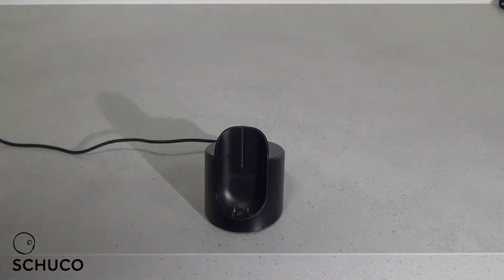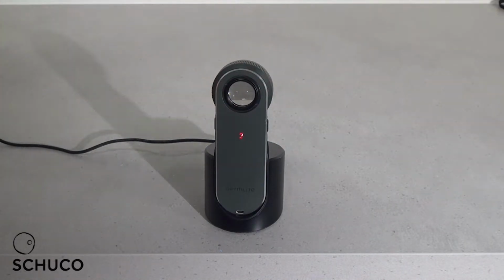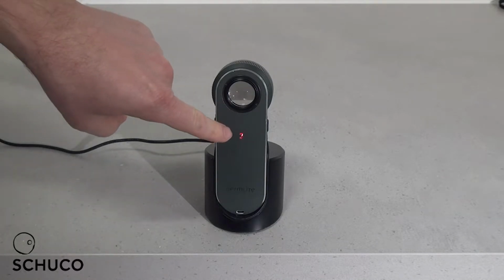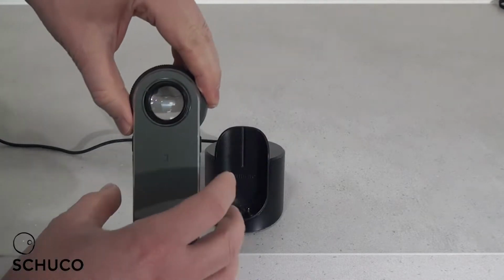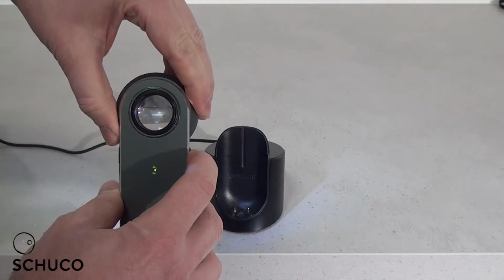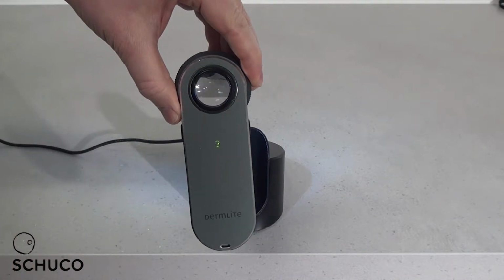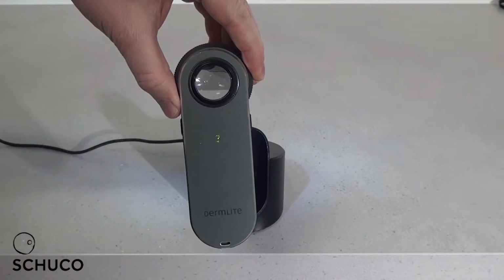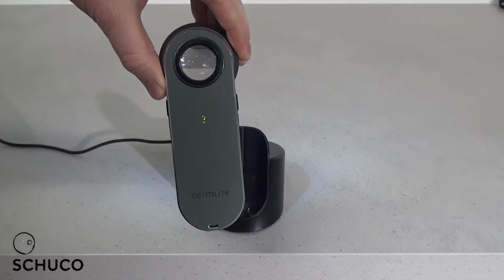So this is the desktop charger. And if you put your dermatoscope on top of the charger, you'll see that the light goes red. That's the color when it's charging. When the device is fully charged, the light turns green. When you turn on the dermatoscope, you'll see green means that it's more than 25% charged. Once the charge is less than 25%, this will go orange and it will need further charging.